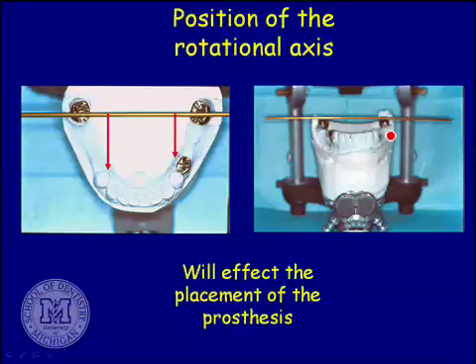And so the thing with this is labs really have to, both the treating dentist and the labs have to be up to speed, but they work really well. How does the patient define it? Are elderly people able to, is this the right rotation? Pretty much. The question was, are these so complex to put in that people have a hard time doing them? Not really. They go in as easy or easier than a conventional partial.